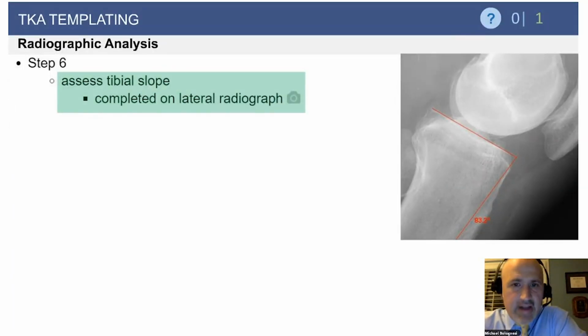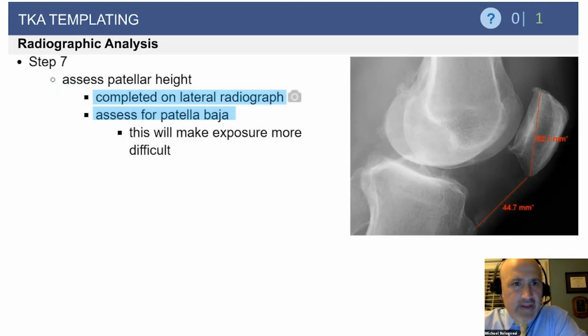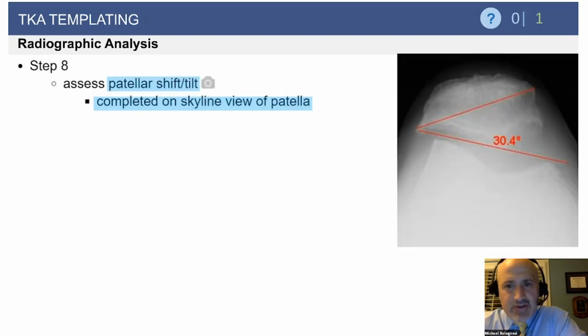The tibial cut, it's nice to draw a line, center of the ankle, center of the tibia, perpendicular to that, make a planar tibial cut. And then assessing bony defects and osteophytes, I think that's easiest on the AP view for sure. I use an implant design that allows me to match or tells me to match the native slope. So this is a nice thing to do and measure on the lateral radiograph. We think that's an important point to point out.